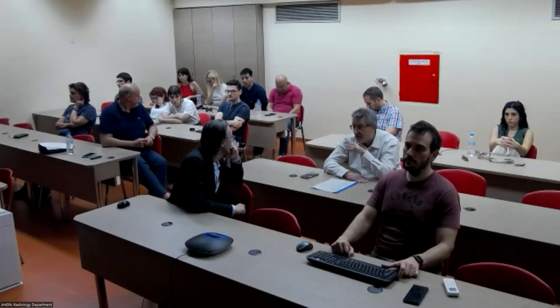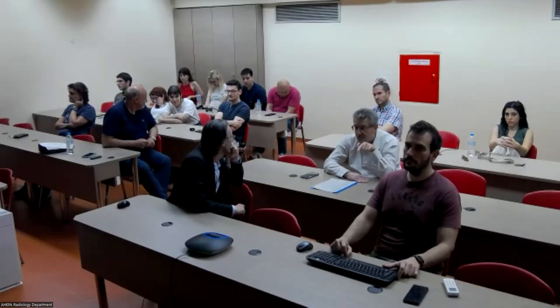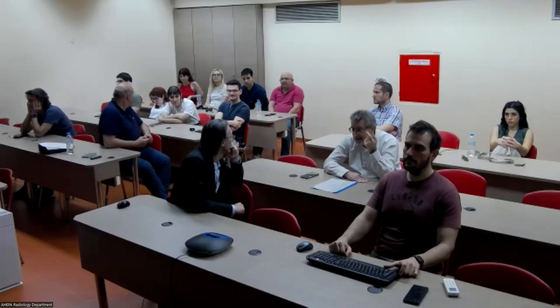And if you see some lymph nodes that are not round and clear and have some stranding in the surrounding part, you should consider that maybe there is a tiny tumor that is not recognized. And of course, the rectum is also a very common site of this type of tumor. Although the rectum is easily accessible by the gastroenterologist, we should consider those tumors there.